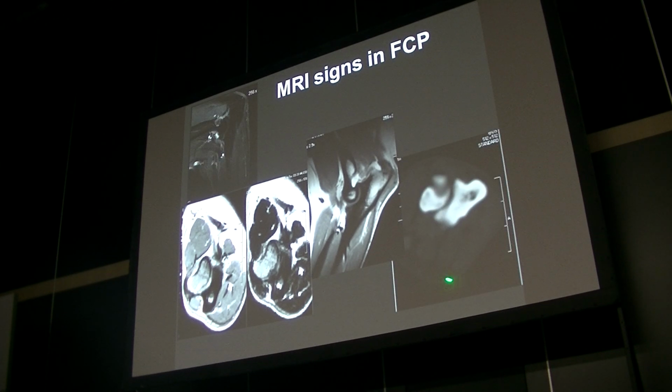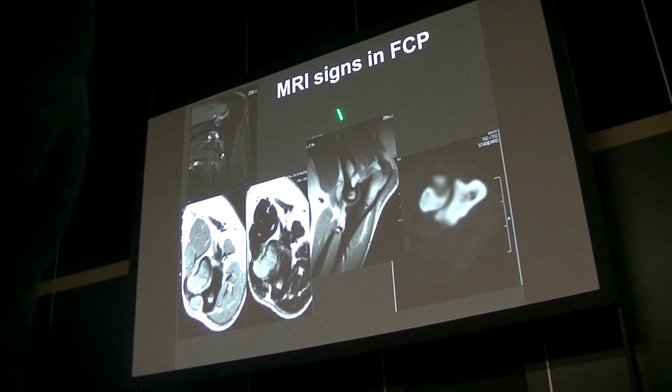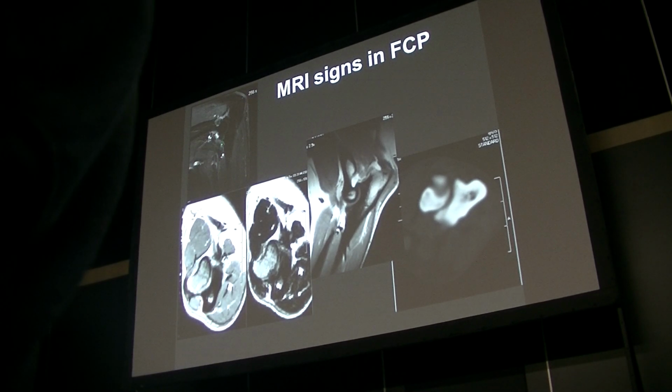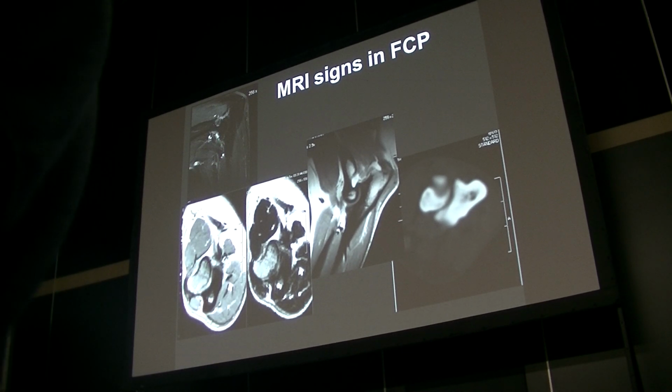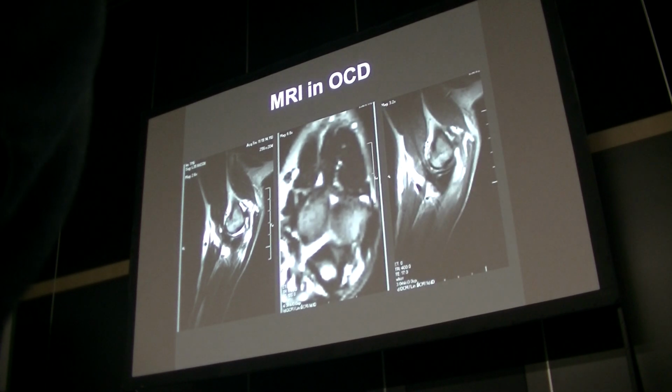And the corresponding CT image here, even on CT it is subtle, a very subtle radiolucent line in the area of the coronoid process. Here it's more clear, a sagittal STIR view, where we see the joint fluid going in between the fragment and the rest of the ulna. So it's of limited use, at least in our experience.